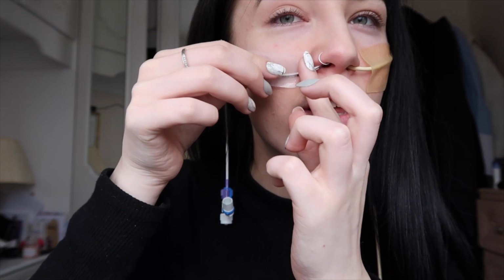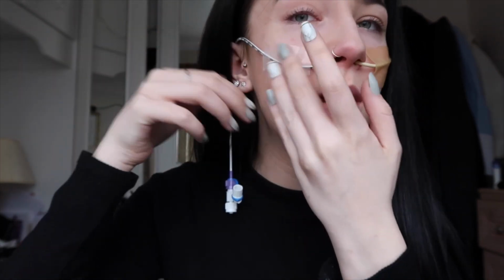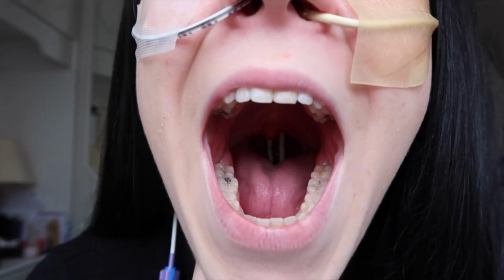Right here, I'm just going to pull it out a bit. About there. Now normally I would have, like I said, pulled the guide wire out because it's quite stiff at the moment. Now, to make sure it's in your throat, not your lungs, all you're going to do is open your mouth. And I'm going to have to shine a torch, but you should be able to see two tubes at the back.